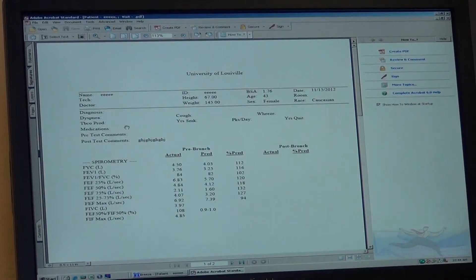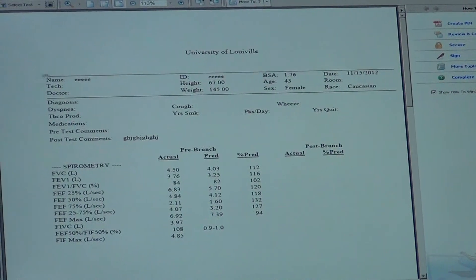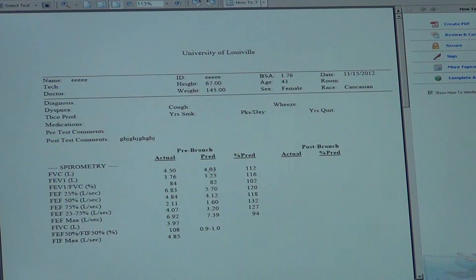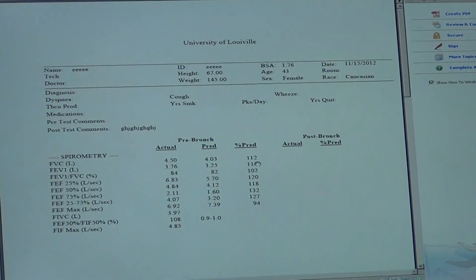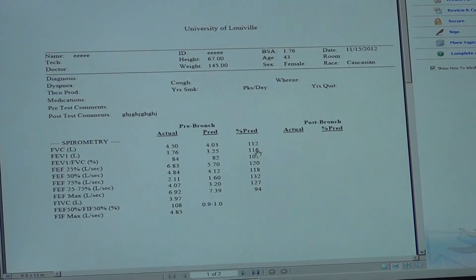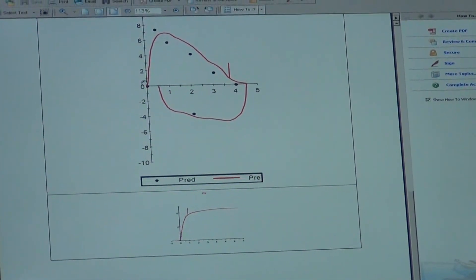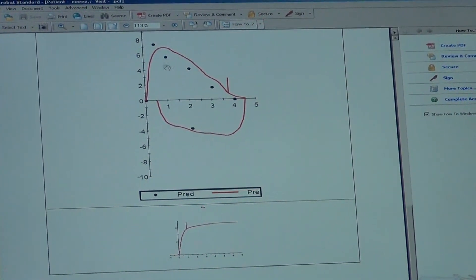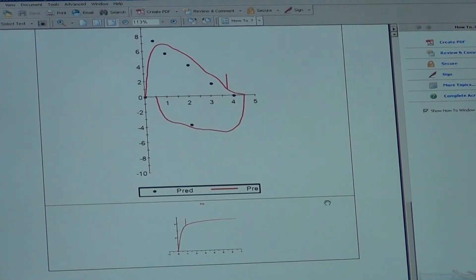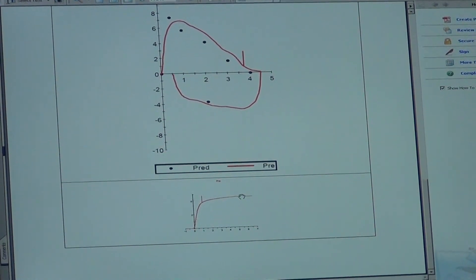The PDF shows the flow-volume loop of the best attempt and the values calculated from the software. This is the report. We have all the information and results: forced vital capacity at 112% of normal, and forced expiratory volume in one second at 116%. The graph shows the flow-volume loop in red with black dots indicating normal values — this subject is above normal. The test lasted more than six seconds, so it is a valid test.